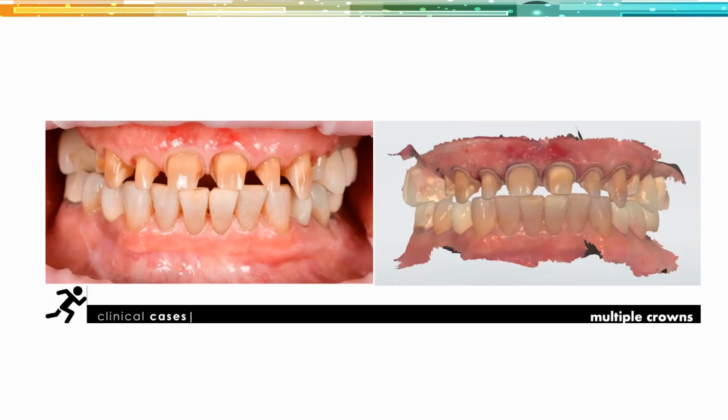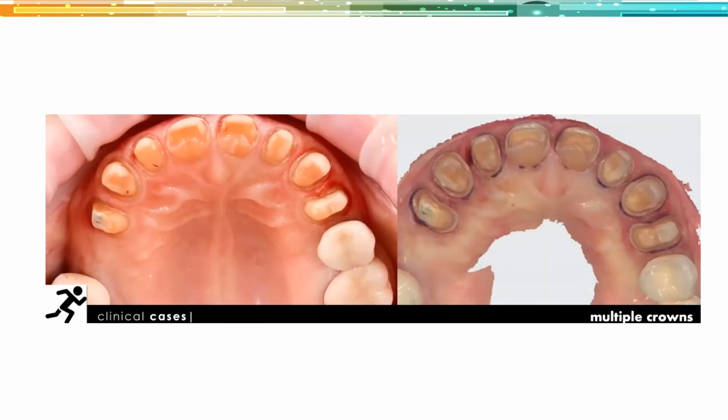We're not rushing to get things at the very end and try to capture every single margin. We can build the most ideal impression or scan over time. And it becomes a very stress-free experience for both us and the patient.